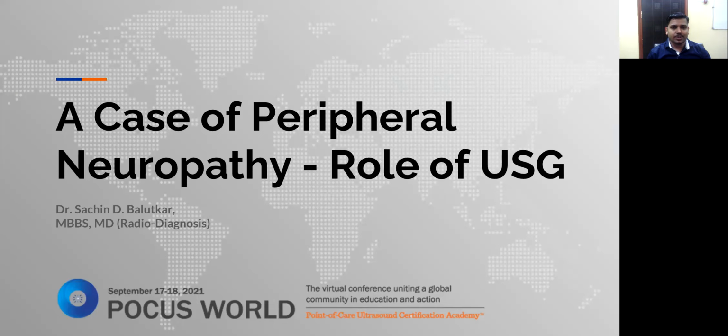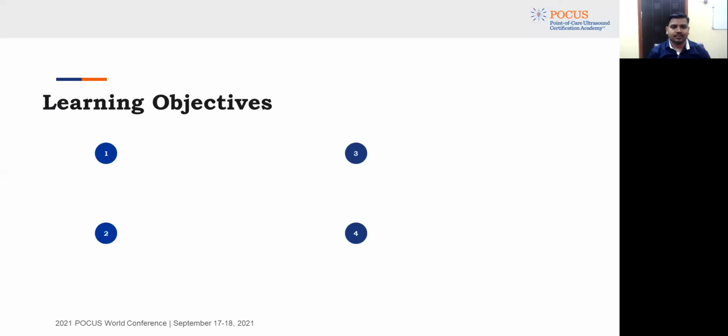Here I will be presenting a case of peripheral neuropathy, emphasizing the role of ultrasound in the evaluation of peripheral nerves. The aim of my presentation is to explain the role of ultrasound in peripheral neuropathy.